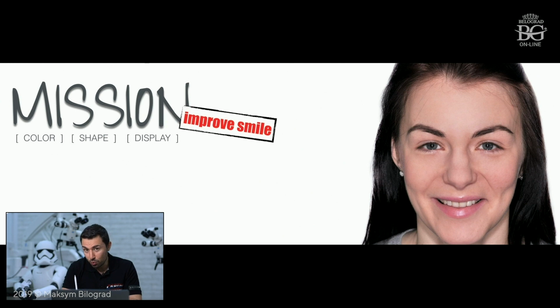In this case, if you imagine a wide smile in this patient, you will definitely see pretty big buccal corridors. So that was the reason why the patient said that my teeth are small and my smile is so narrow, and I would like to improve everything with restorative and aesthetic treatment.